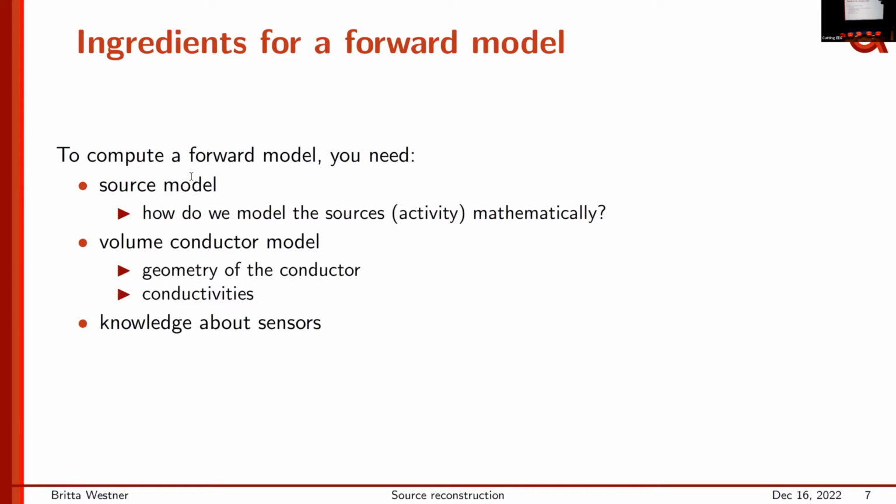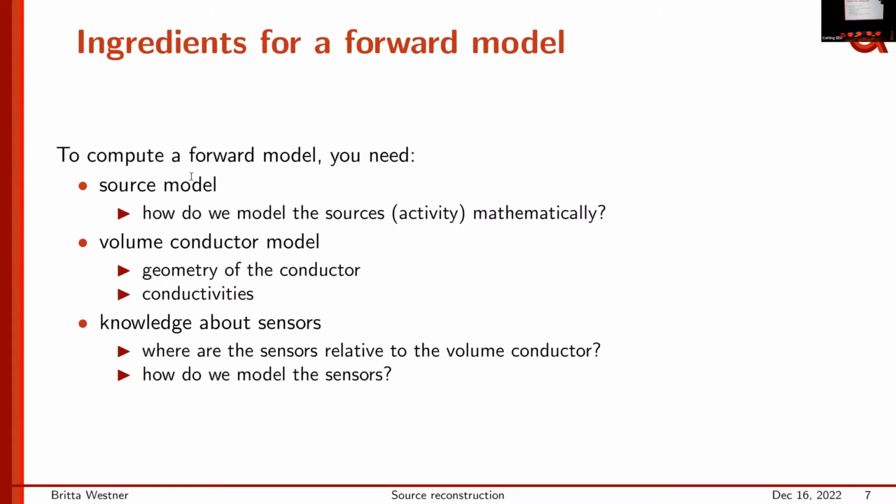And then sometimes forgotten about, you also need knowledge about your sensors. Where were those sensors relative to the volume conductor, so relative to the head, and how do we model them?